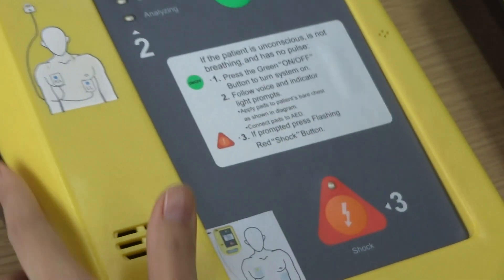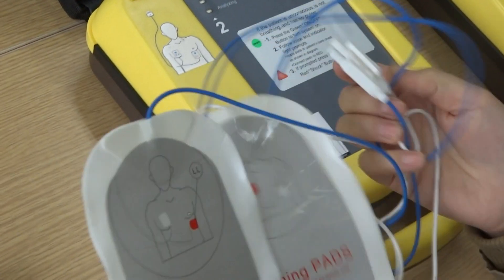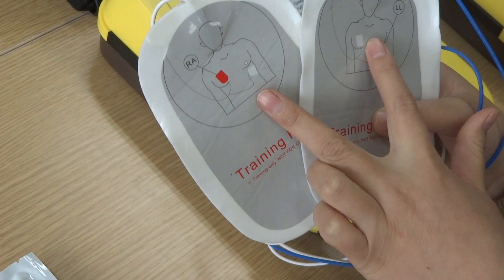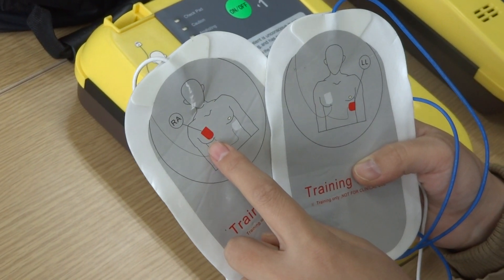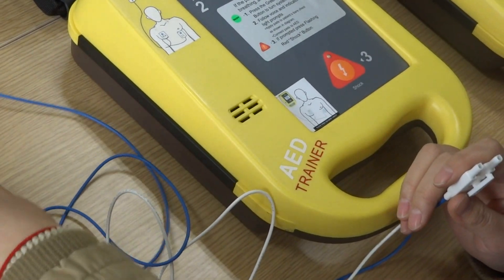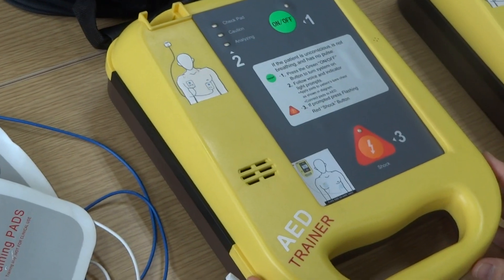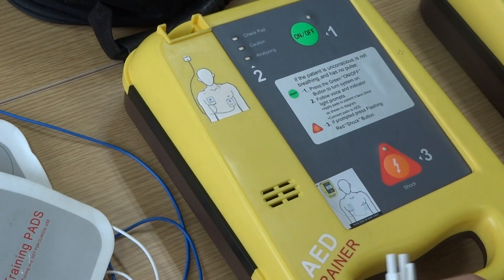Now we can run the operation. First, we need to paste these two electrode pads on the patient's body. The pasting must follow the two picture indicators on the pads, meaning we must find the accurate location on the patient's body.